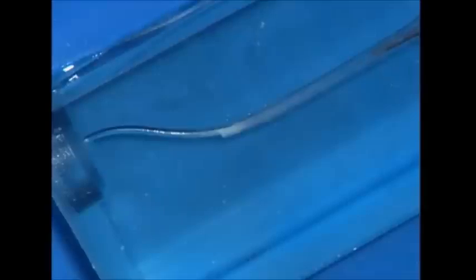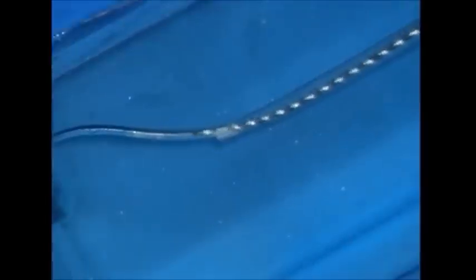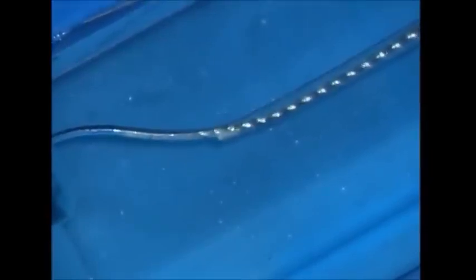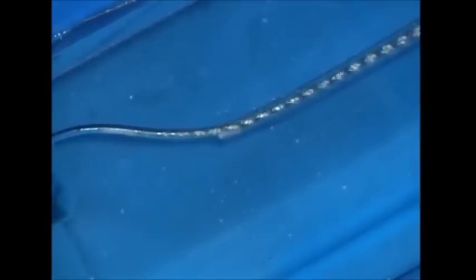Little short amplitude strokes move debris into solution, so that when we re-irrigate, we can flush out some of this debris. Again, the pre-curved file is brought into the root. It's orientated so that it moves past the ledge and a little bit deeper into the canal. I want to emphasize the importance of taking short little strokes when the file is apical to the ledge so that we can smooth and refine this region of the canal.